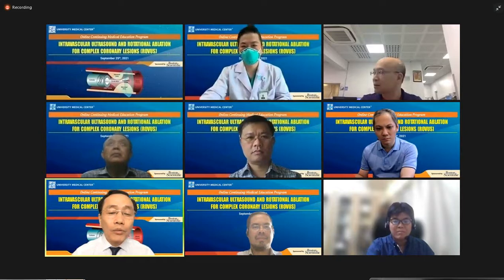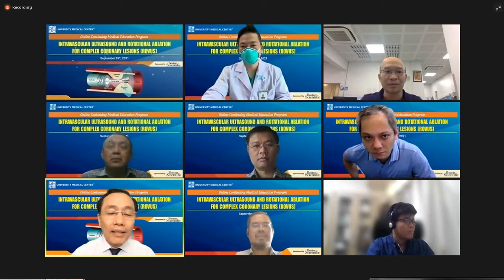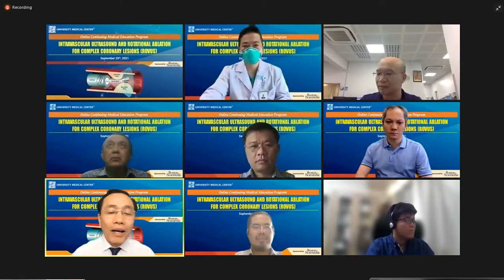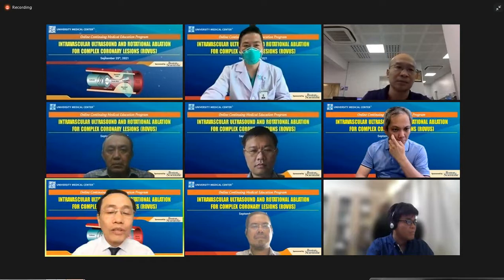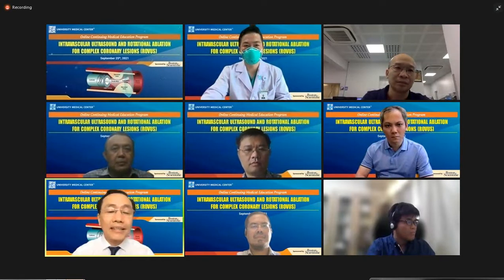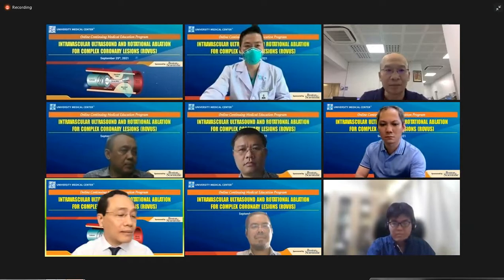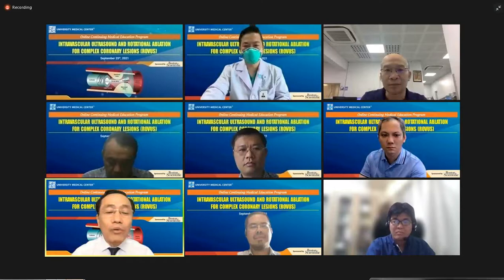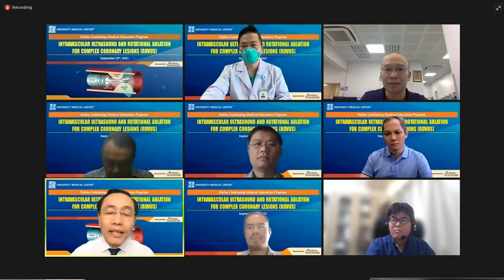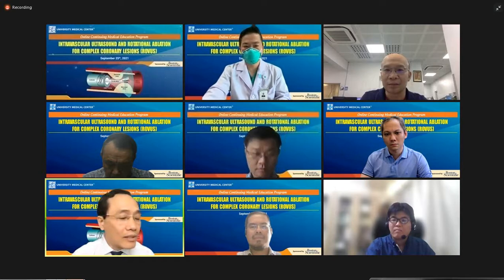So we need to use devices, for example, IVUS or OCT or FFR, to assess the lesion, to choose the trajectory for PCI, to size the stent, etc. So very important. How can we do this? The speaker today and the panelists will share with us their knowledge and experiences in doing IVUS for bifurcation lesion.